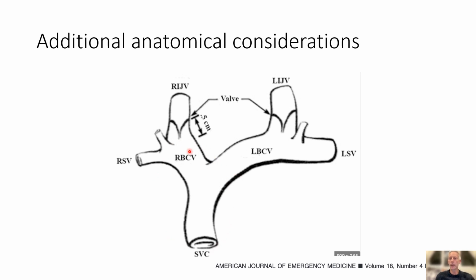It is notable that the IJ may be splinted open by the negative intrathoracic pressure, valve, and intersection of the internal jugular, the subclavian, and the brachiocephalic vessels at this location. Because of this, an IJ may seem to taper just above the clavicle in the same patient lying at 10 degrees or 60 degrees. This could be interpreted as an elevated CVP at 60 degrees and a normal CVP at 10 degrees. Therefore, we need to exercise caution assigning the height of the JVP with the probe at the level of the clavicle, as the IJ can be seen to distend at this level independent of CVP.